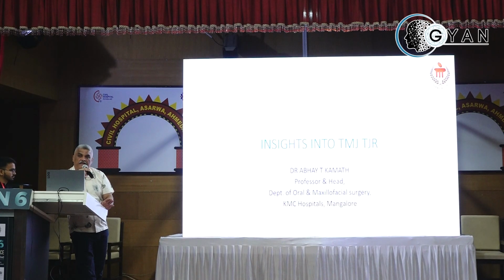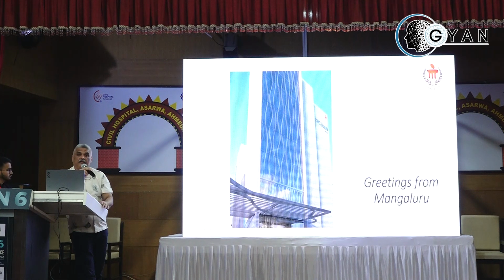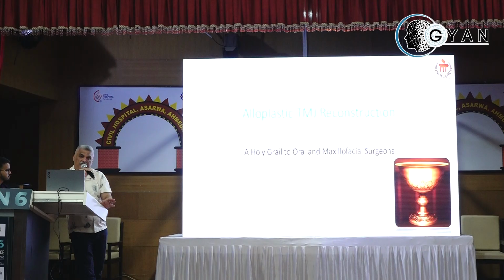I consider TMJ replacement the holy grail for the maxillofacial surgeon, because we have thrown all our hammers through various incisions, balancing acts of arthroscopy and arthrocentesis, and finally we have zeroed down to doing TJRs, or total joint replacements, for patients who present with a variety of conditions, which includes ankylosis or end-stage TMJ disorders. That's where your TJRs come into play.